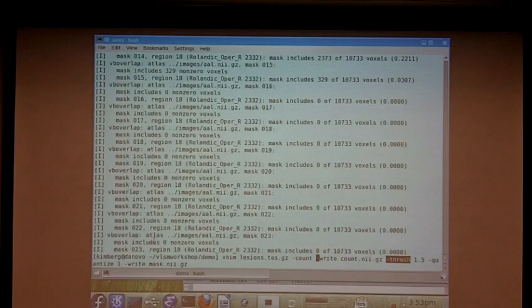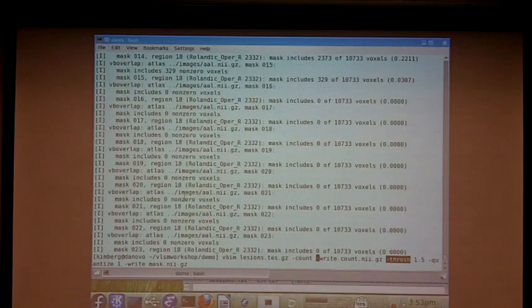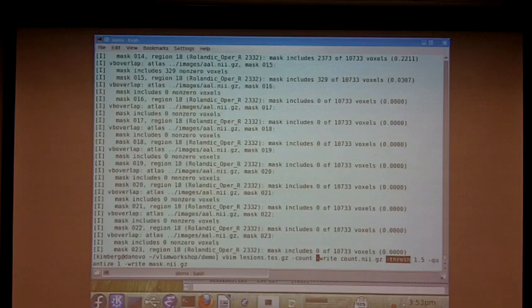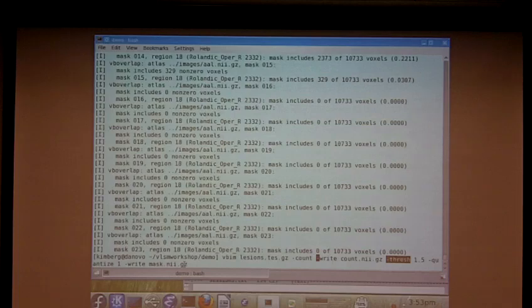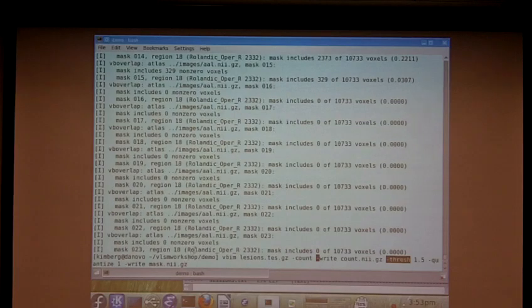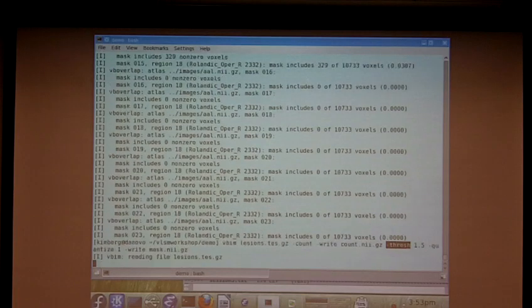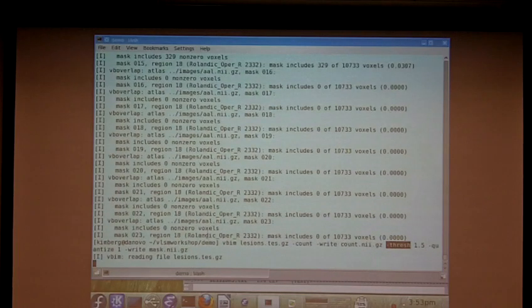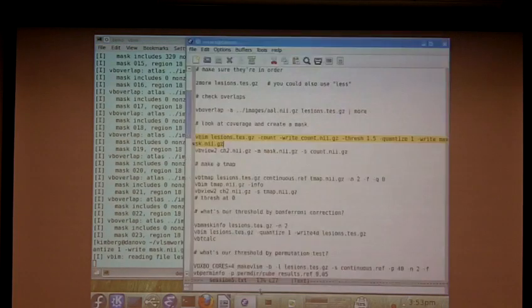I usually do something like 1.5 because I can never remember if it's greater than or equal to. So quantize it to 1 and then write out a mask. So what this does is it creates a mask of all the voxels that are where you have at least two lesions.